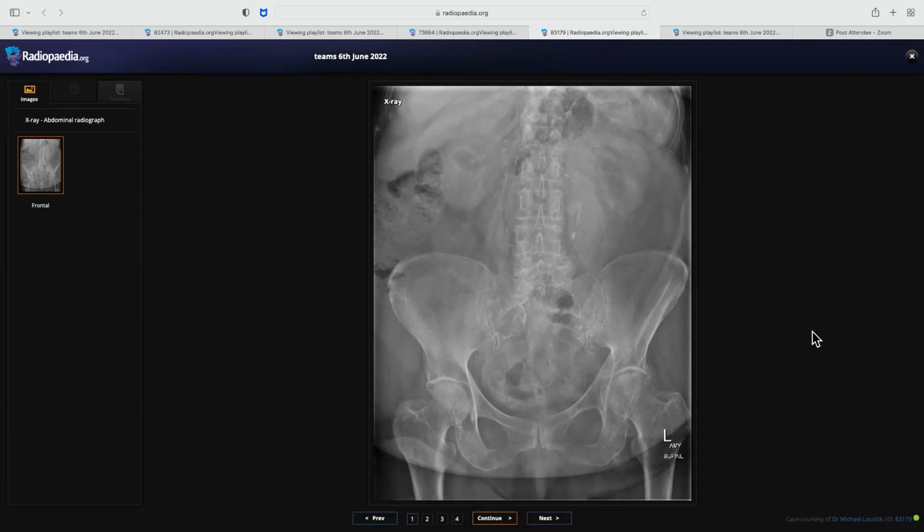If the patient had an aneurysm, what would have caused severe pain at this point? What do you think? There may be some leaking from this. Okay, so what will you do? The patient should have a CT with intravenous contrast.